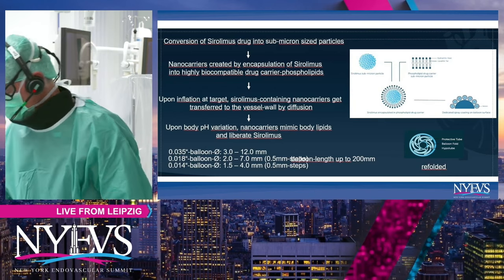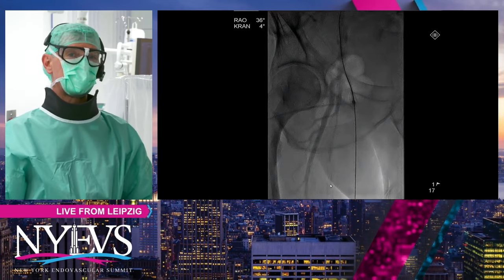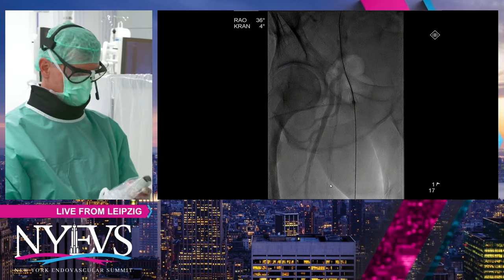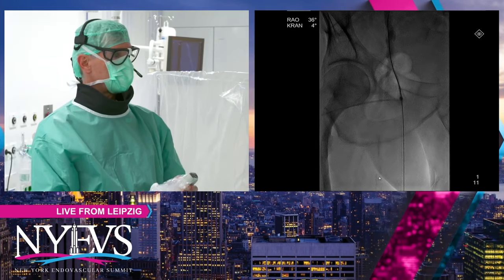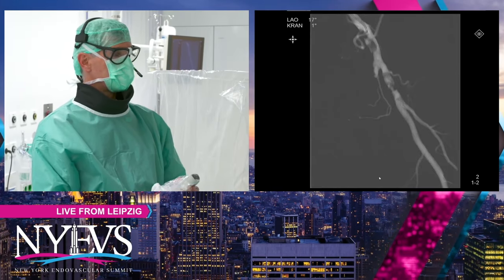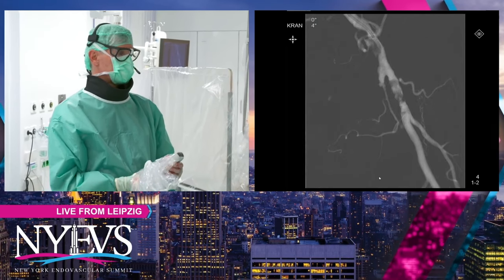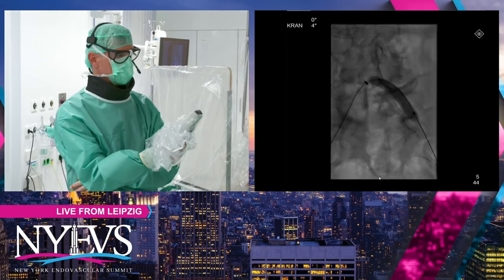If we can switch to the angio. This is the right groin, very short common femoral artery, and then crossover. This is once again the lesion. Of course, it's very hard to go crossover, very calcified.